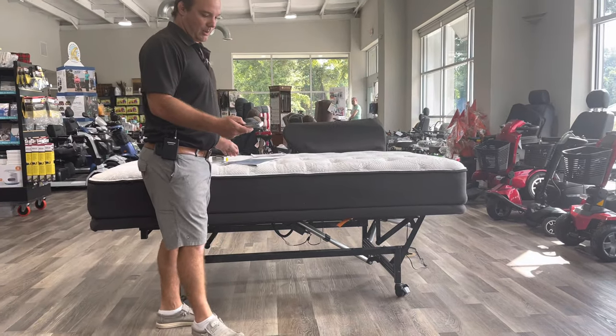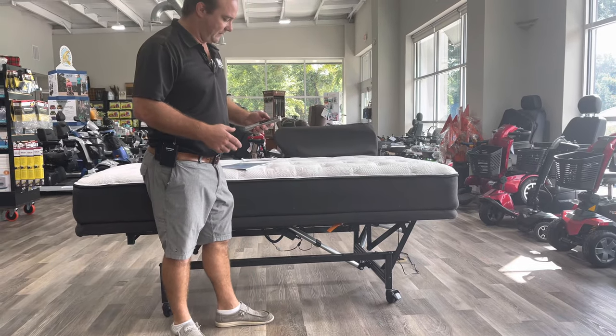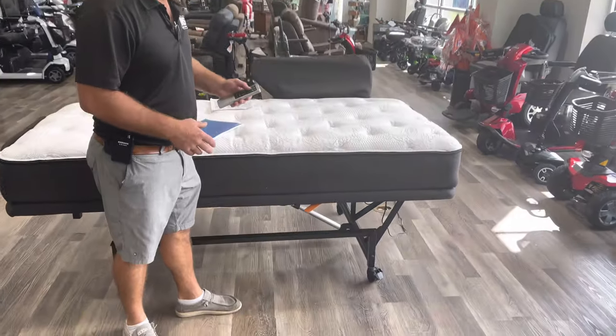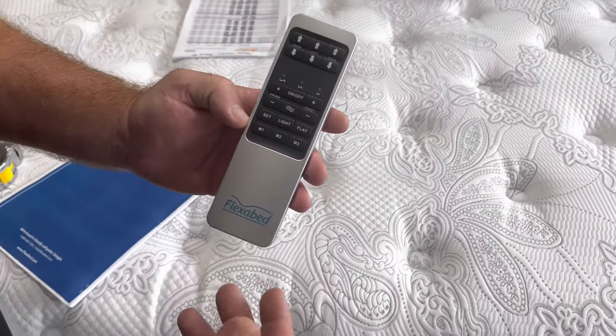We're using a wireless remote. This one actually has a light at the bottom and it has a massage feature — the massage is just a vibration. Here's your remote on the wireless. You can also get a wired remote; this one is wireless.